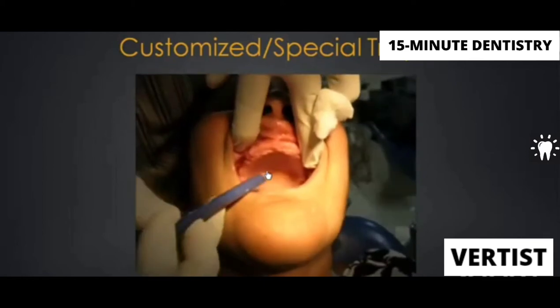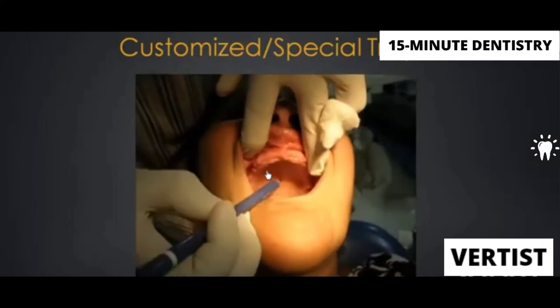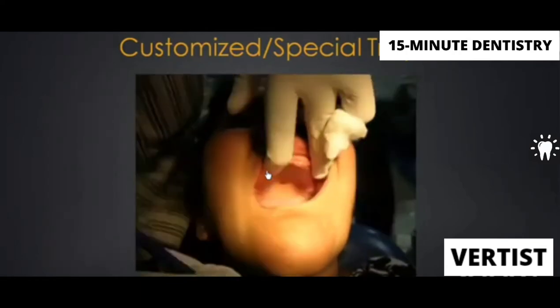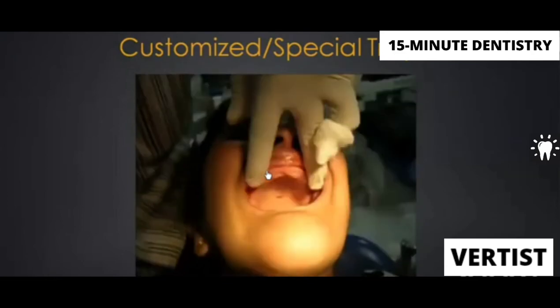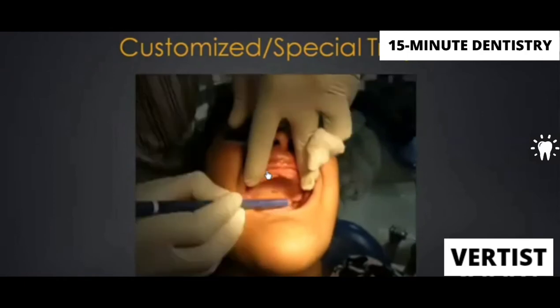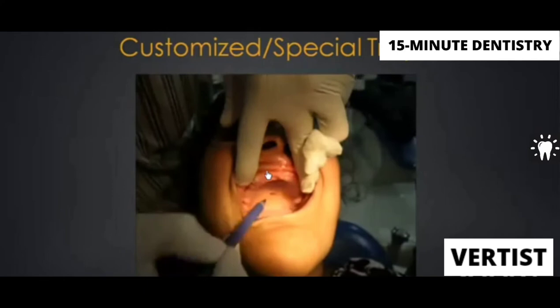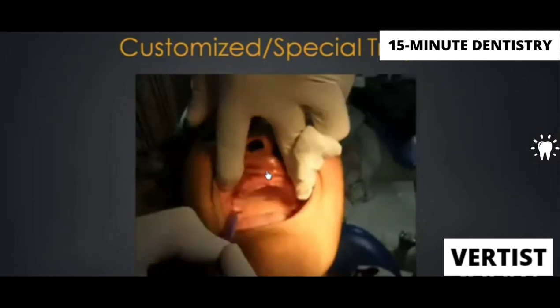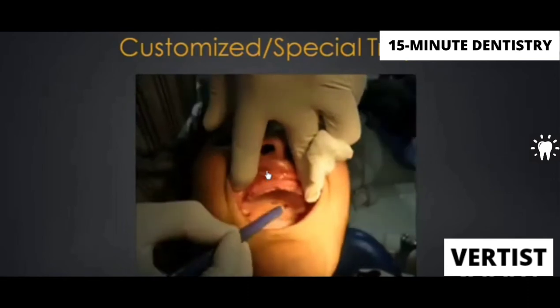Okay, so once we know where our hamular notches are and where our posterior vibrating line is, we take a marker, we nicely wipe off the palate, dip the marker in spirit and mark this line. Okay, it is very important that our tray is extending right up to this line, not shorter, not more than that, otherwise our border molding would not be correct. It is very important. I am telling you again and again, because this is a mistake which most of us make. Most of the times it is quite overextended. Don't keep it overextended.